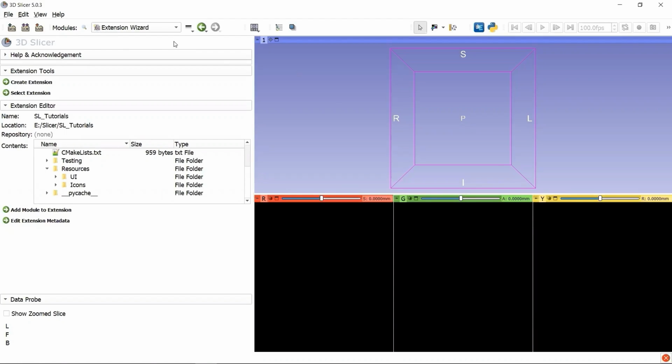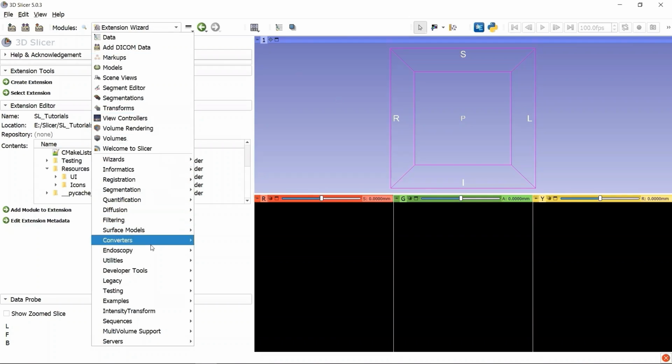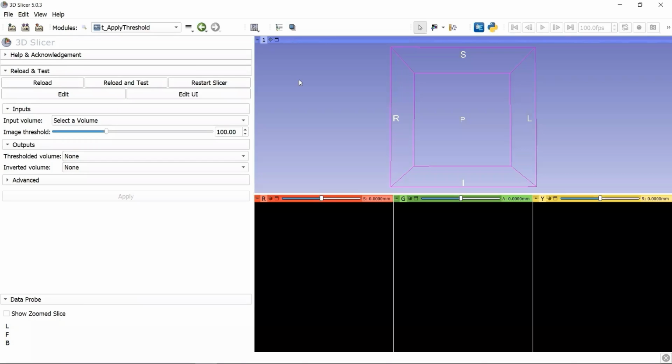So how do we boot up the extension module we just created? We need to go to the module selection again, and find the category Examples, t-apply-threshold. Remember we changed the category from Examples to Tutorials? This might be a small bug of 3D Slicer. To fix this bug, let's go to the module we created, click t-apply-threshold. Now we are in the module t-apply-threshold, the template module created by 3D Slicer.